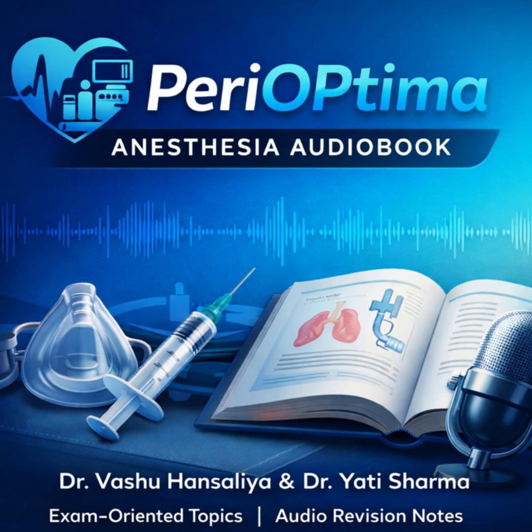And why is this an anesthesia topic? I mean, why isn't this just for the cardiac surgeons or the intensivists? Because the anesthesiologist is central to the entire process. We're often the ones managing the patient during the insertion in the cath lab or the OT. We manage the TEE, the transesophageal echo, to guide the cannula. We manage the transport of these incredibly unstable patients. And most importantly, we manage the complications in the ICU. We're there from start to finish. Looking at the question patterns from the DNB questions topic-wise source we have, this comes up constantly. It's not a fringe topic.